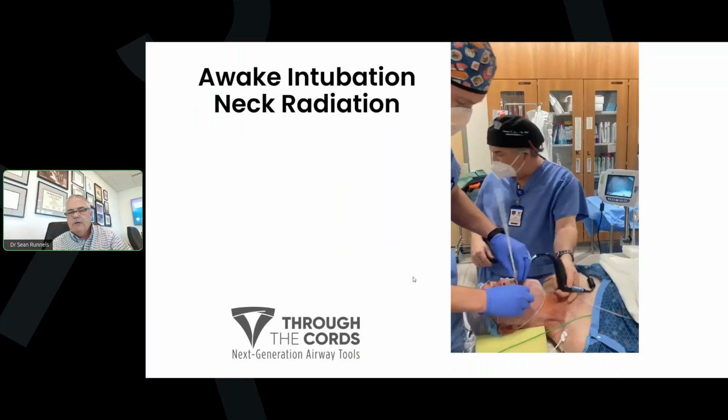The prep time is low because there's not a lot of force, so you don't need to do the deep blocks. There's not a lot of deep force. Patients do not like it when you touch their trachea from the outside or the inside. So the less force, the easier on the patients, and the less time we need to prepare the patient.